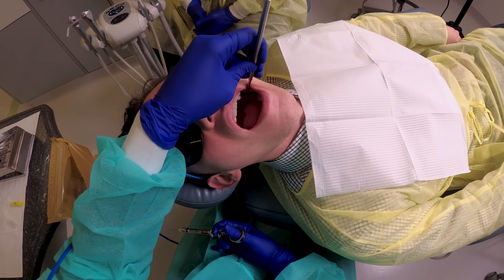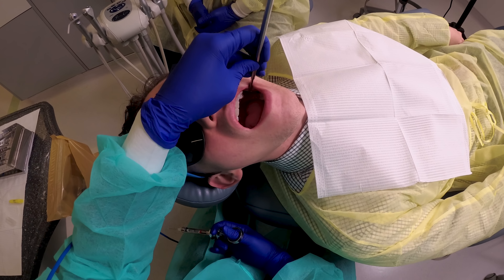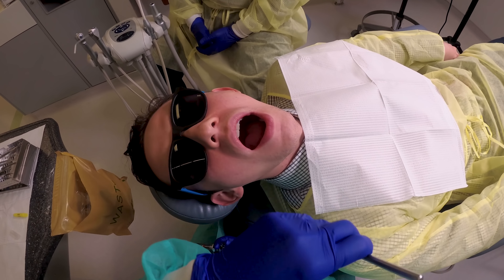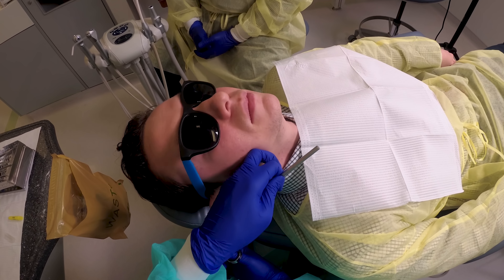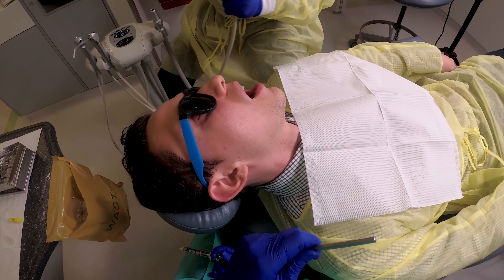At this stage, you may go ahead and provide the necessary anesthesia. As this varies by procedure, individual injections are covered in separate videos.